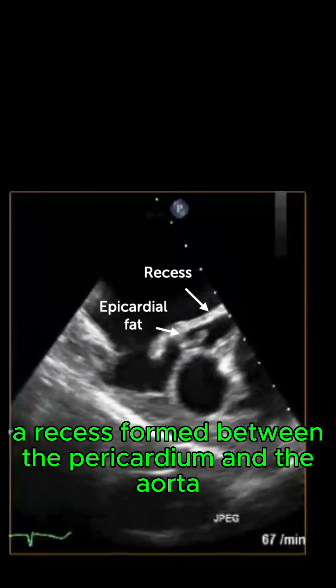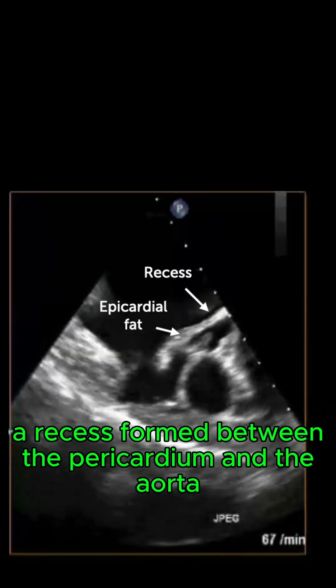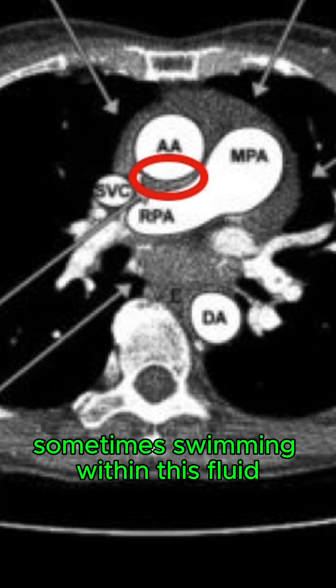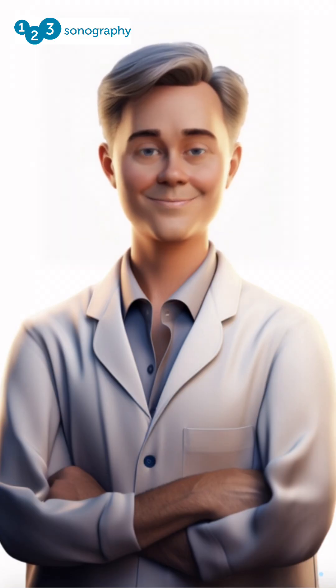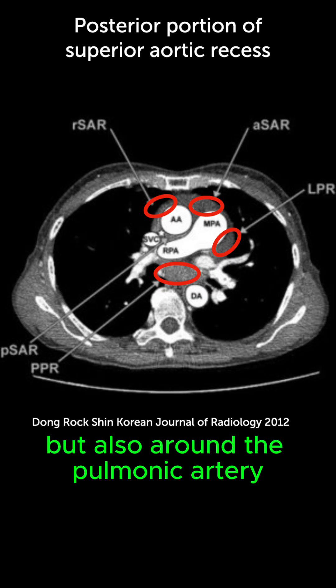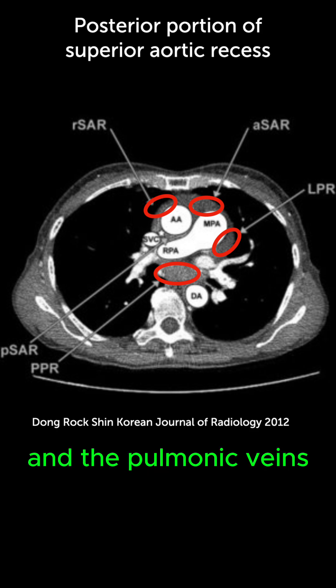A recess formed between the pericardium and the aorta. If fluid accumulates, you will have an echo-free space and you will see epicardial fat sometimes swimming within this fluid. Now a recess can be present anterior, posterior, lateral of the aorta, but also around the pulmonic artery and the pulmonic veins.